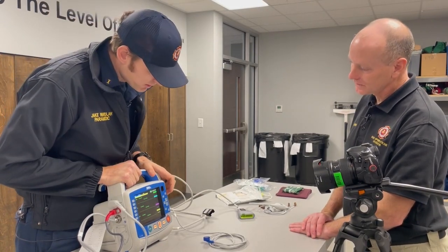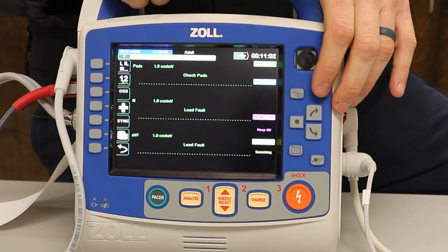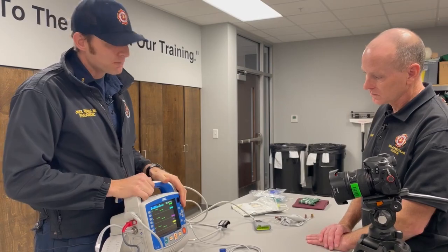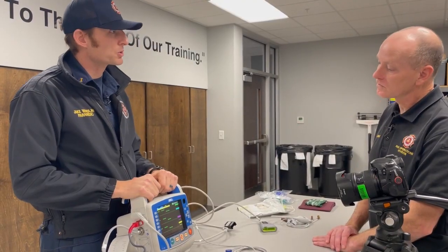Perfect. So the general, it looks like an alarm bell. When this thing alarms, you can silence it. Oh, good. At the moment, it's not alarming. Hopefully throughout this scenario, we'll be able to actually put it into practice. But all I got to do is hit that alarm button. It will silence it. It's not forever. It's roughly about a minute, and it will start alarming again.